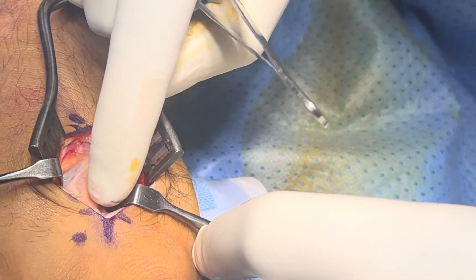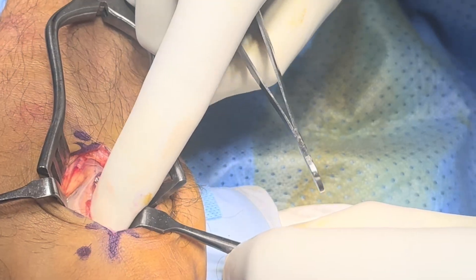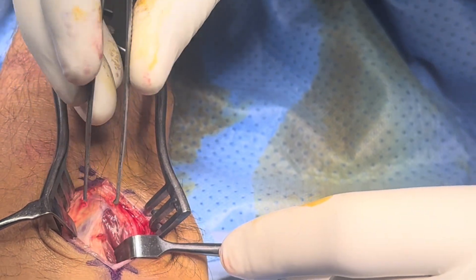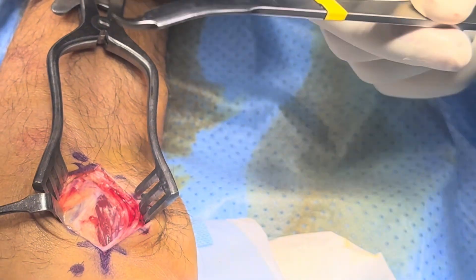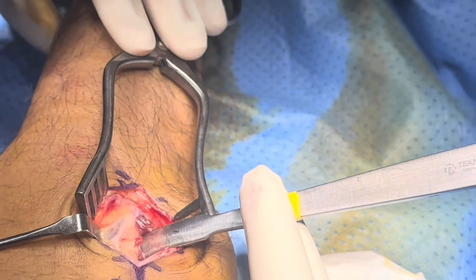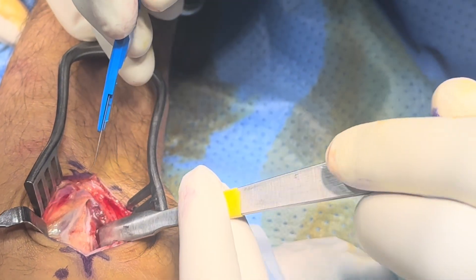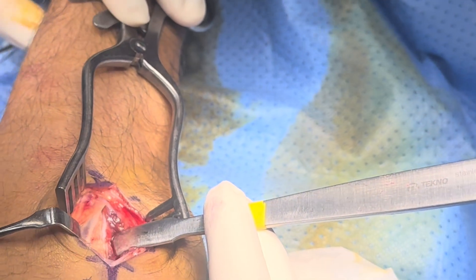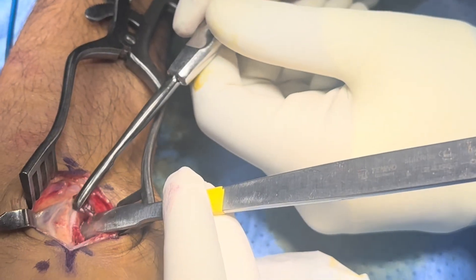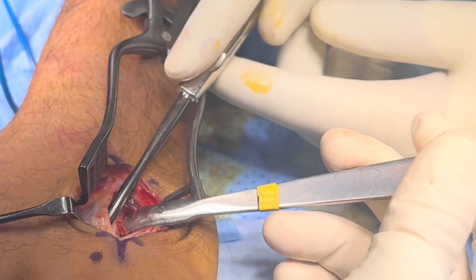Now put the finger and try to sweep — try to sweep the interosseous here. This is the fracture line you can see, right there.